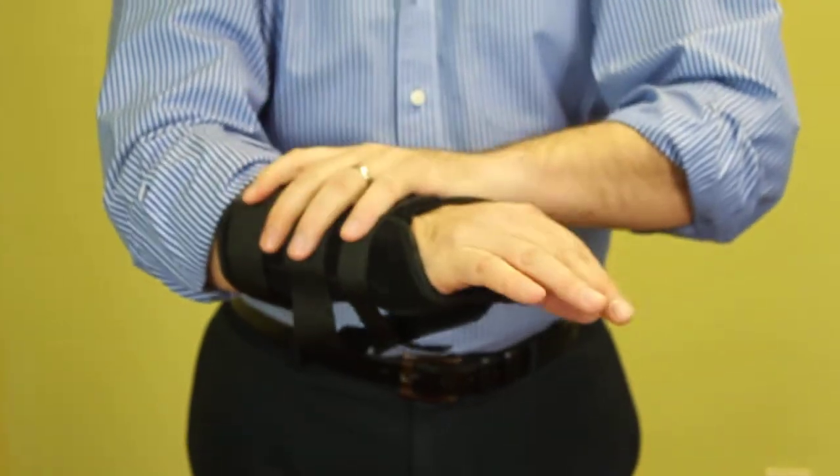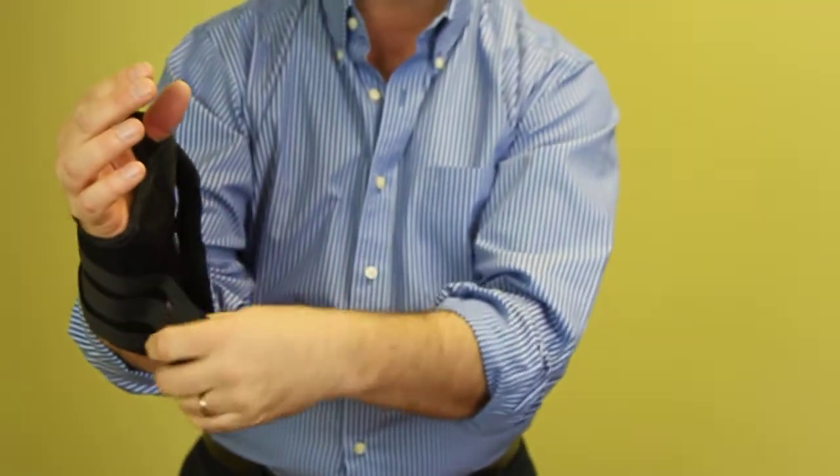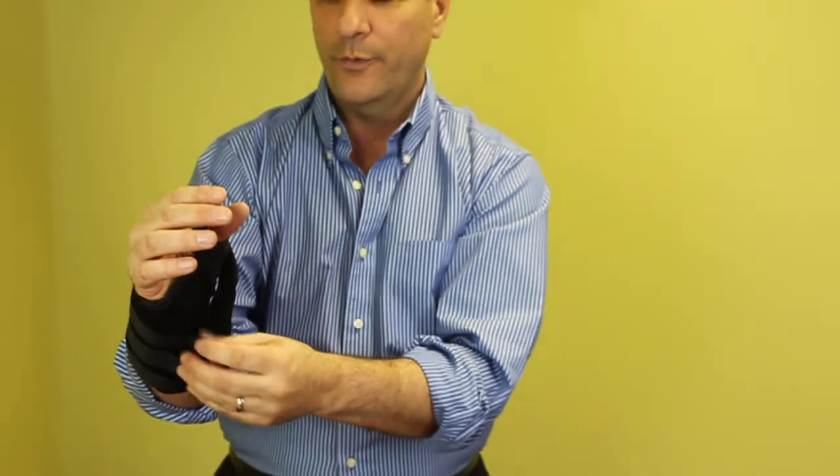Once you have the proper size for your wrist, you can take these straps and cut the excess off, so it's not going to be a hindrance and it would fit exactly for you.